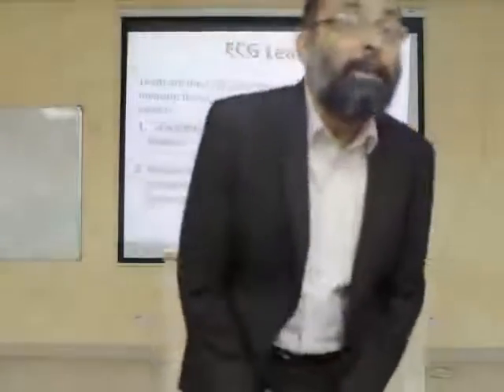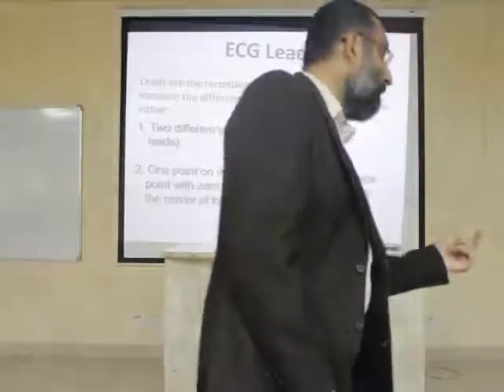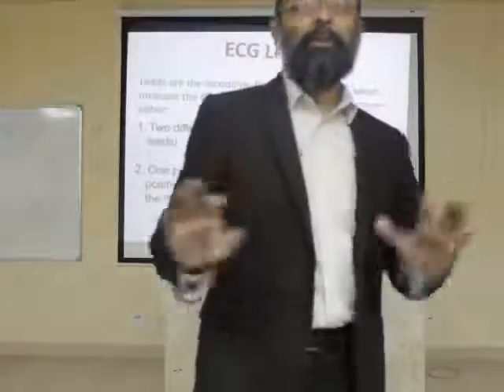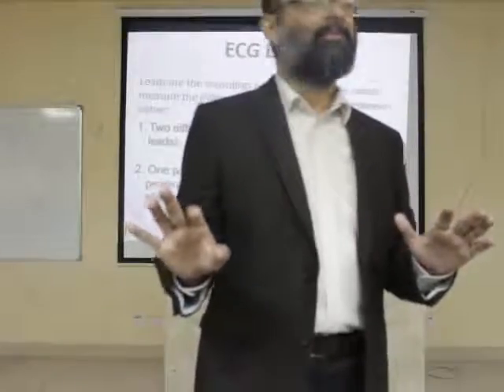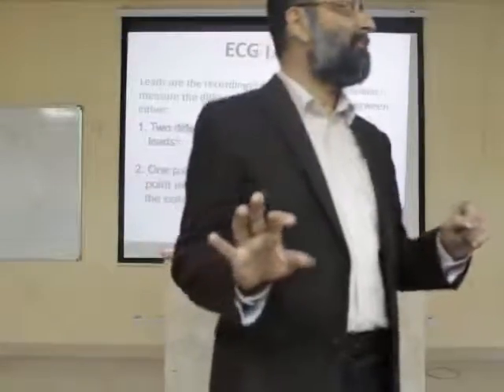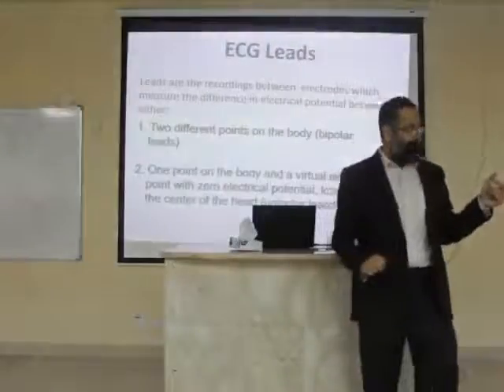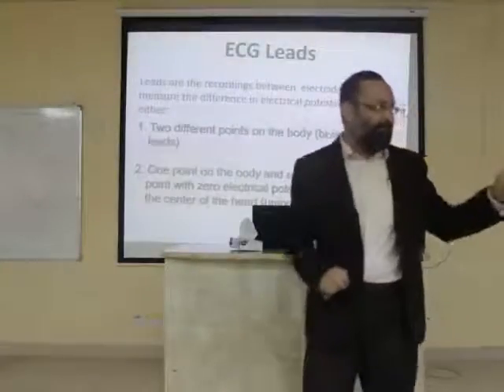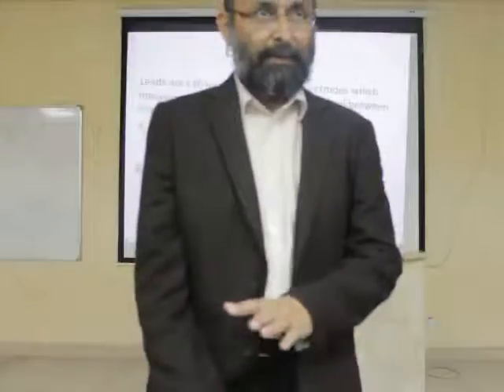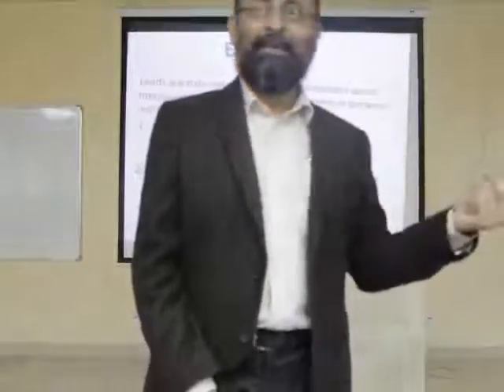Coming to a unipolar system. What should this word mean? Unipolar. It's either positive or negative. If you are using negative, do you think there will be a current flow? So it means, what is necessary? Positive is necessary. If positive is present, and it's a unipolar system, then what should the other pole be behaving as?